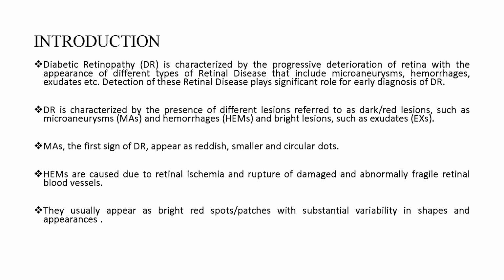ophthalmologist for early diagnosis. By evaluating changes in the retinal layer thickness, early identification of retinal disorders such as glaucoma, diabetic retinopathy, age-related macular degeneration, and even cognitive degenerative diseases such as dementia has been demonstrated to be beneficial. There is no visible evidence in the retinal structures in the early stages. Early diagnosis is achievable, however, by establishing the precise changes in the retinal layer.